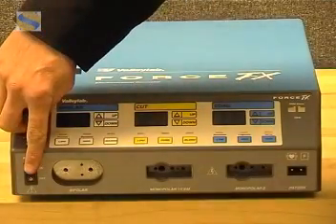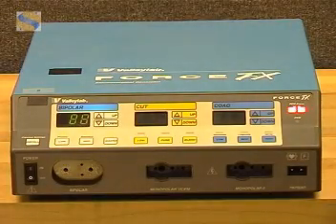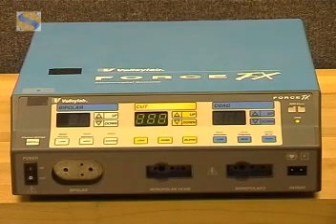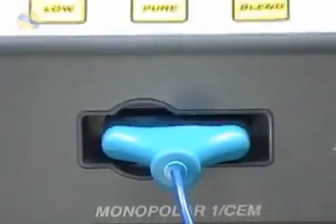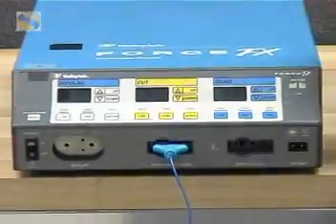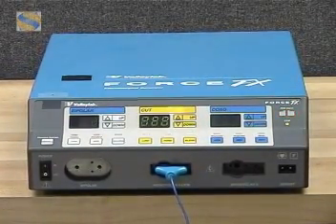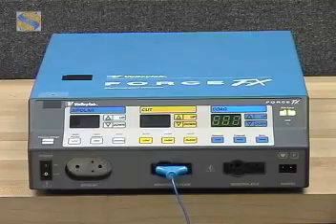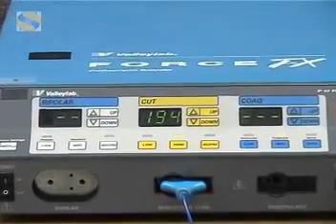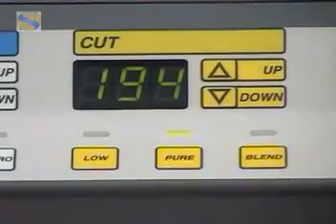When the machine is switched on, it goes through a self-testing sequence to determine whether or not all internal components and external accessories are working correctly. To demonstrate this, we have plugged a finger switching instrument with a faulty cut switch into the monopolar 1 connector on the front panel. This is recognized by the diathermy machine as it goes through its test sequence. In this case, it shows the appropriate fault code in the cut window.